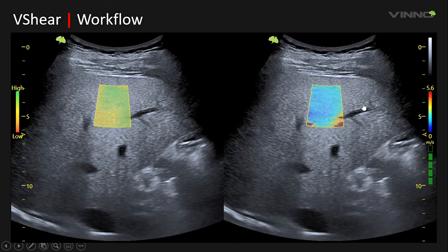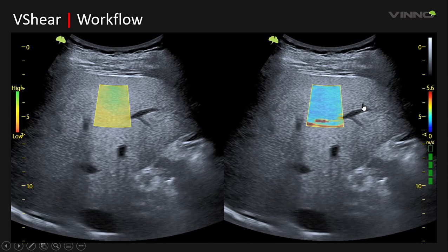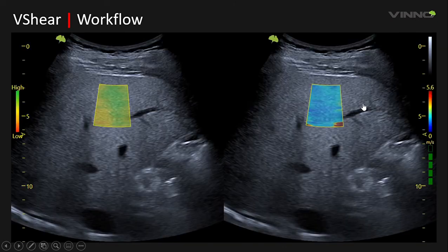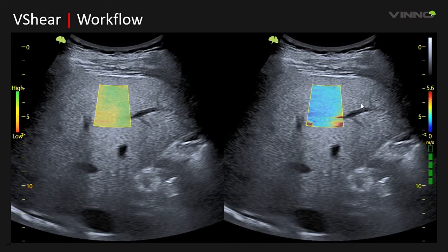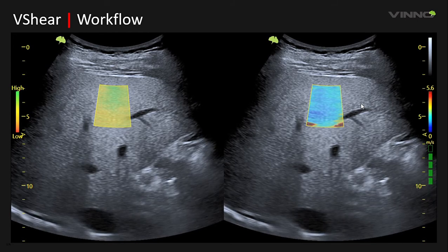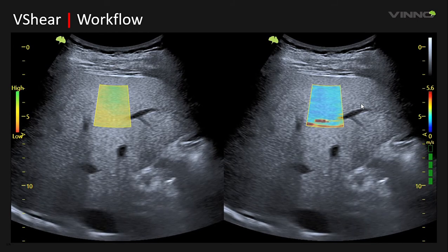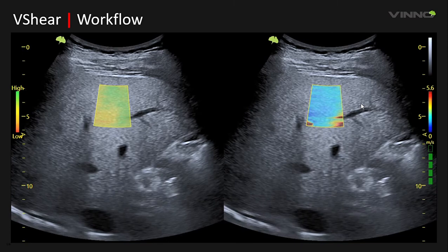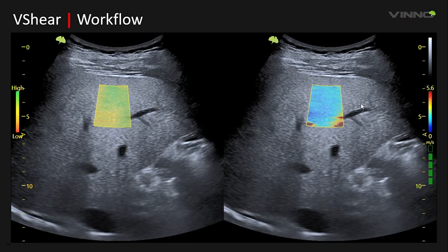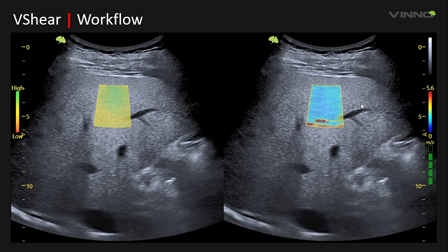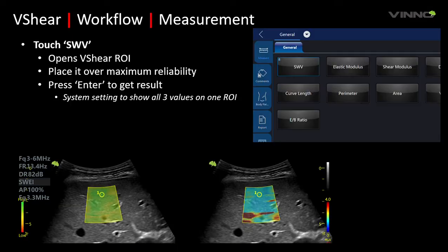This image shows a real-time clip. Observe the patient who is holding their breath to check whether there is any lateral movement of the liver. Also observe that the reliability map shows maximum reliability in the majority of the area, and look for the motion indicator showing green at the maximum level. On the appropriate frame, proceed to measurement.